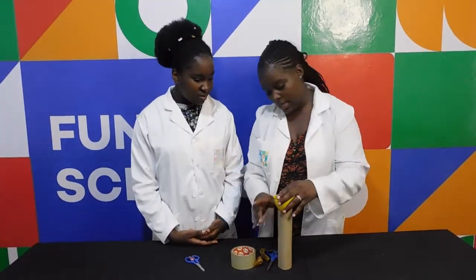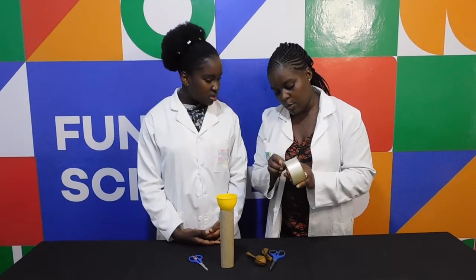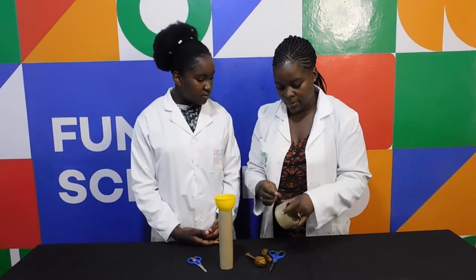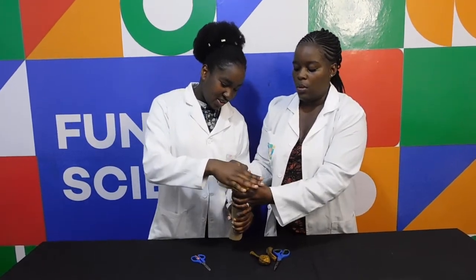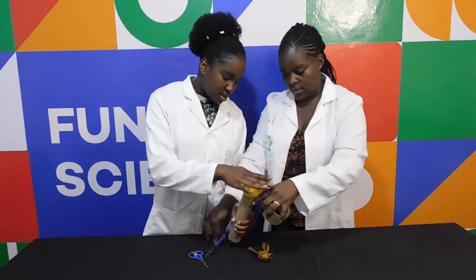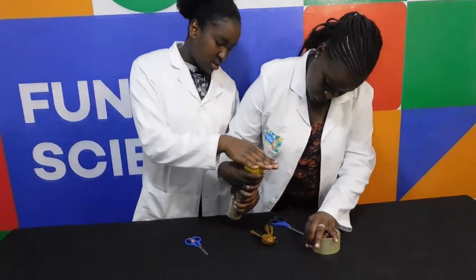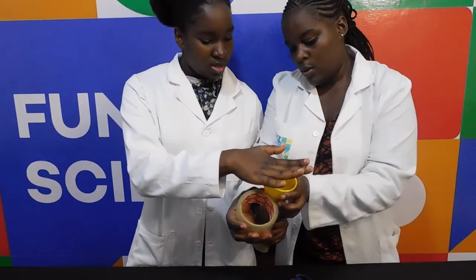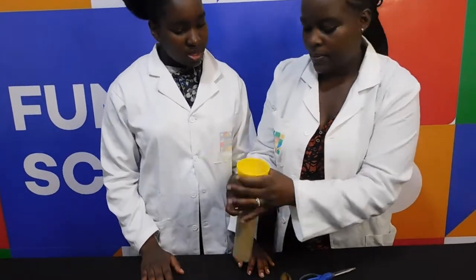Then with our funnel, we're going to stick this funnel to the cardboard roll using Scotch tape. Fantastic! Thank you for holding it for me! Is that tight enough? Is it stuck? Let me just cut something. Stuck on top.